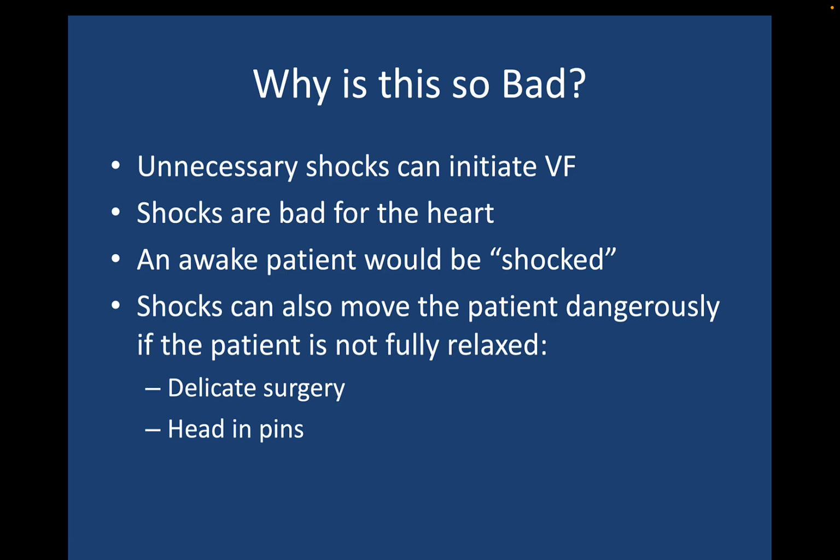Now, why is this so bad? Why is it bad that the patient got a shock? Well, this is probably obvious, but unnecessary shocks can initiate VF. Shocks are bad for the heart. One of the reasons that we stopped doing NIPS procedures to test whether an ICD was going to do what it was supposed to do was because they found that every shock causes a slight diminution in cardiac function.